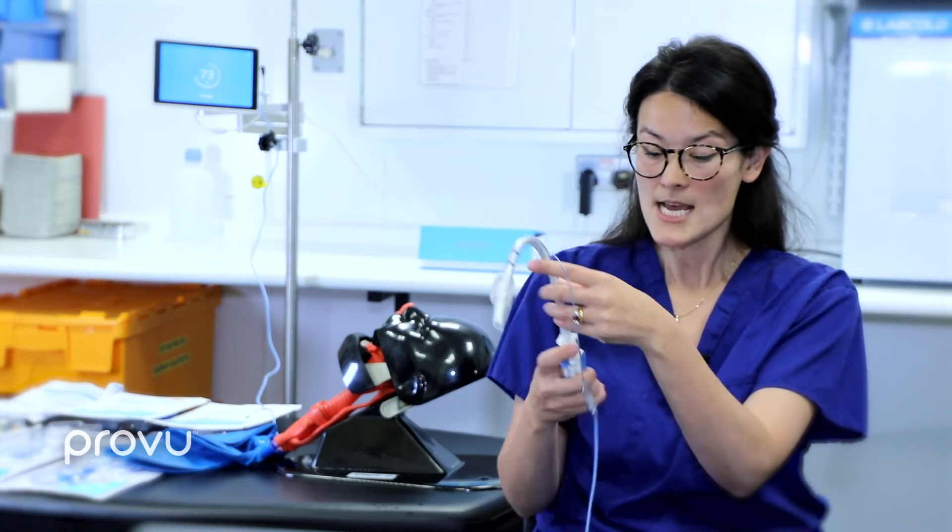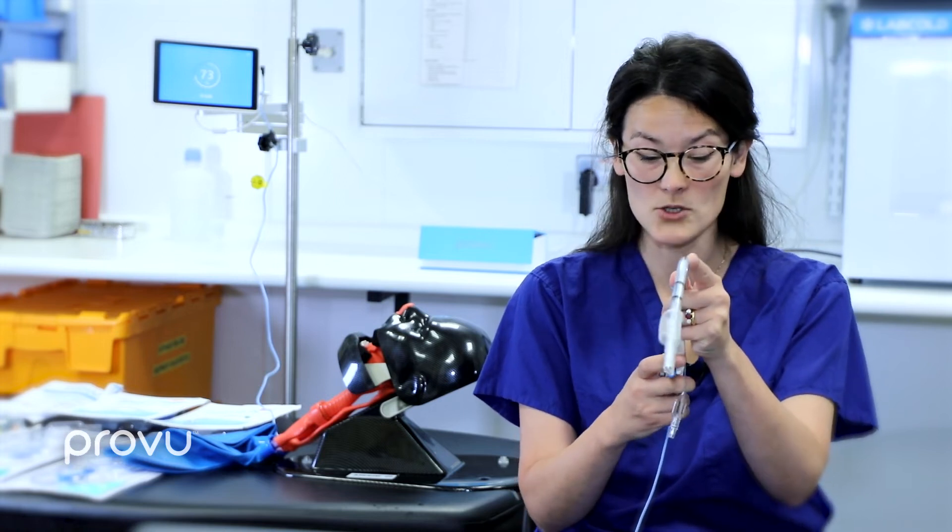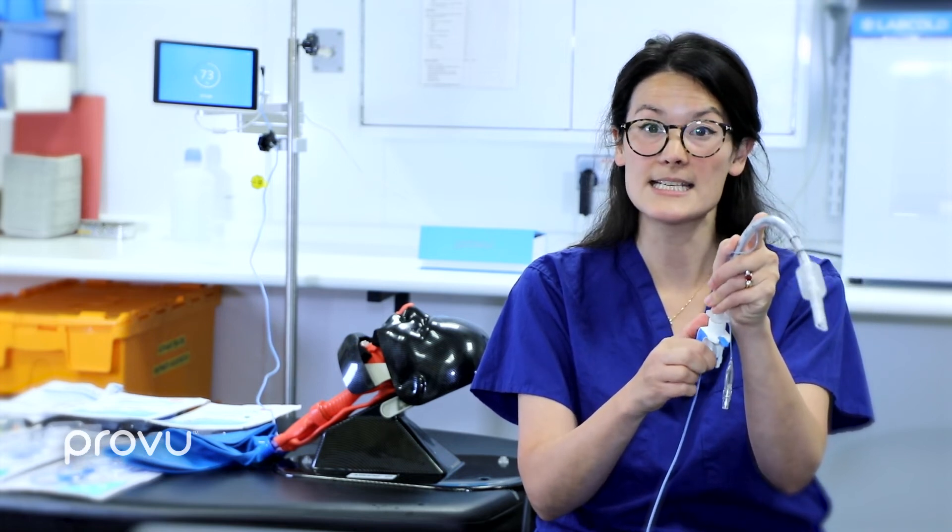In our hospital, when we perform awake oral intubations we stand in front of the patient. This gives great eye contact, allows communication throughout, and lets us assess the patient's degree of sedation. It also helps with the patient's own ventilation when sitting upright. However, when intubating an upright patient you hold the tube in the upside-down position, meaning you cannot operate the bi-directional wheel with one hand. We found it useful to hold the tube with the left or non-dominant hand and use the other hand to move the bi-directional wheel.